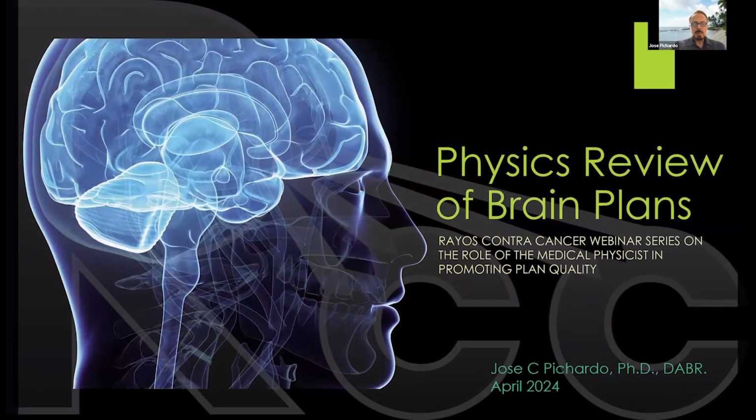Welcome everyone to the fifth session of the RCC webinar series. Today, I'm going to be presenting what we recommend that you should review as part of your brain plans to ensure that you have a high quality plan.